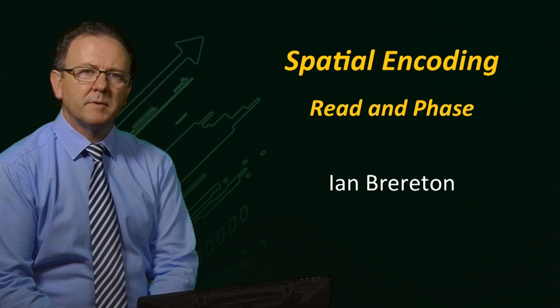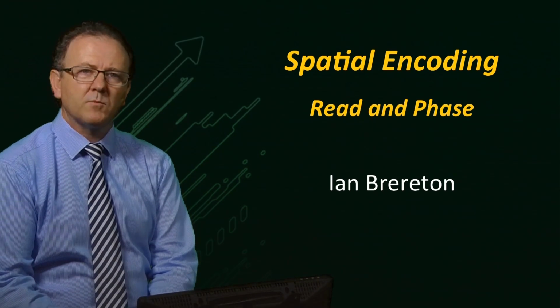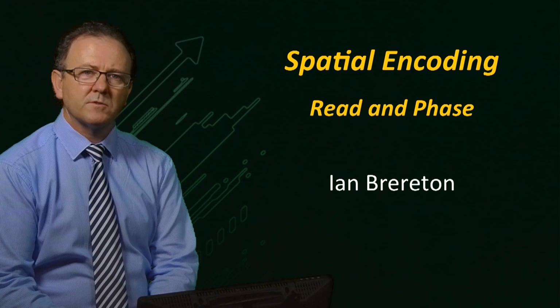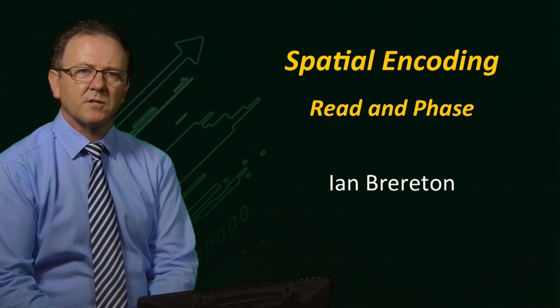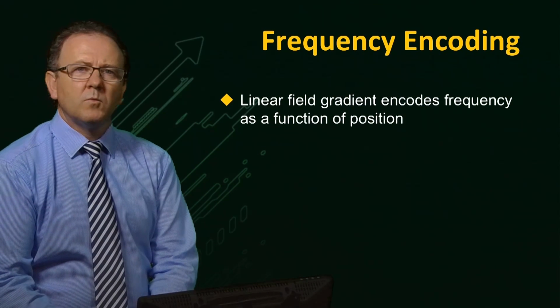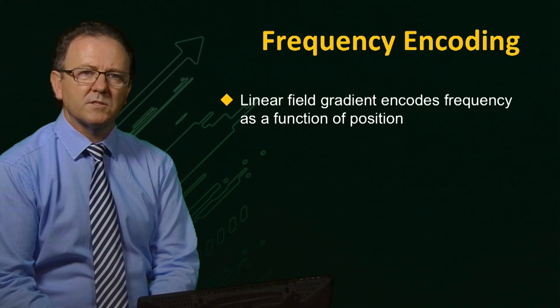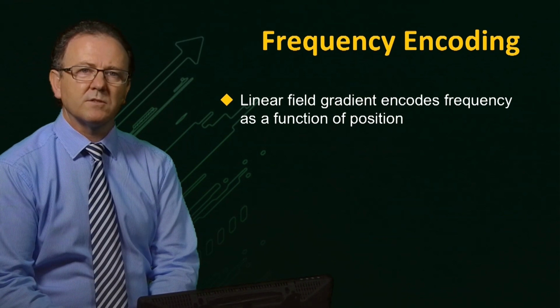So we have seen how a B0 field gradient can be used to spatially encode the frequency of the spins along the direction of the applied gradient. And together with a frequency selective RF pulse, we can select a particular slice of spins. We can use this same idea to spatially encode the signal from within this slice of spins in each direction.